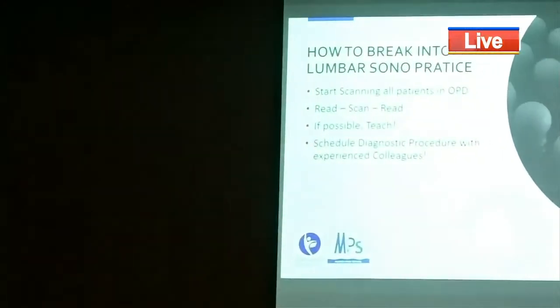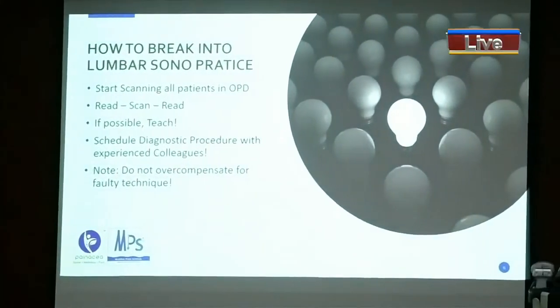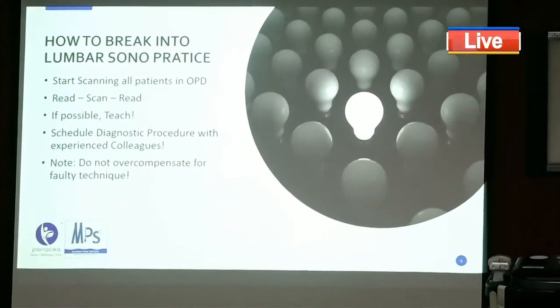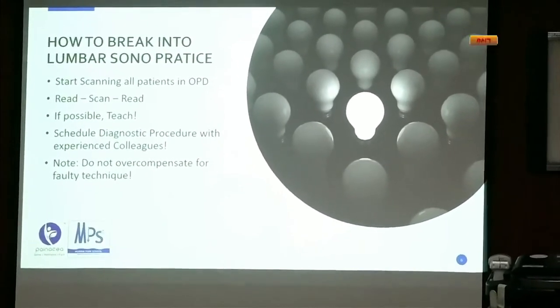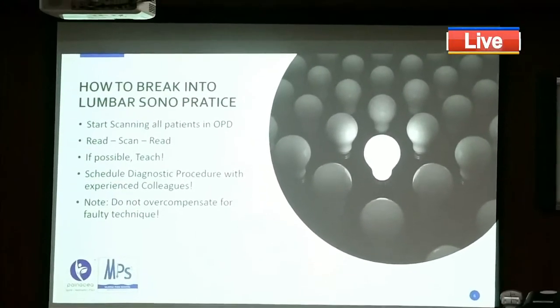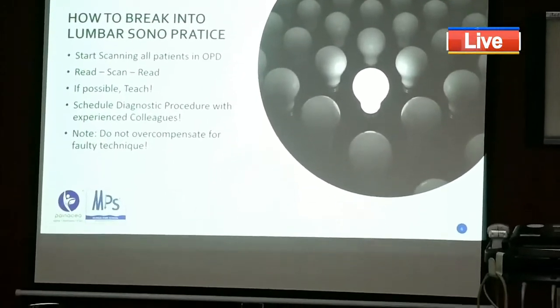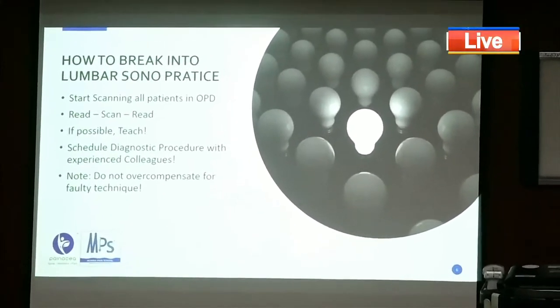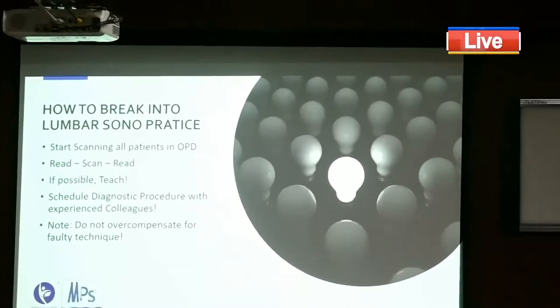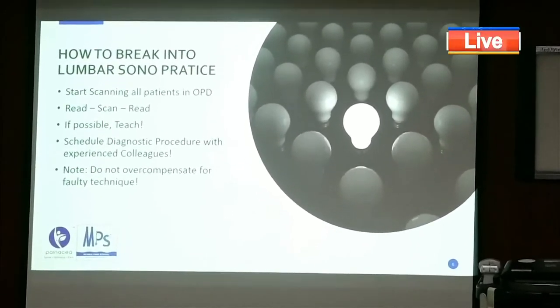And then of course, this is the biggest pitfall. There are lots of pitfalls. I just want to cover up and finish. So I am going to give you the biggest pitfall, which is do not overcompensate for the faulty technique. The needle did not reach where it was supposed to. Let's give 2 ml extra of the drug, who knows, it may reach there. But if you are in the wrong plane, no matter how many ml extra you give, you are never going to reach there. And instead, you are going to possibly give a complication to the patient. So never overcompensate for your faulty technique.